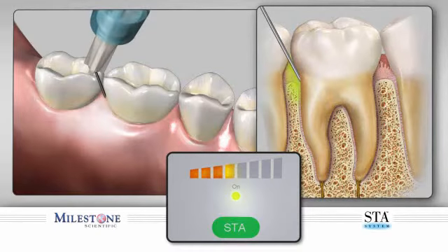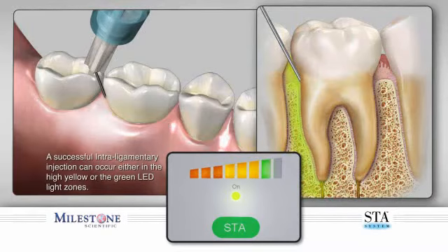Advance the needle forward slowly into the sulcus. Move the needle gently down into the sulcus until you reach resistance. Maintain approximately a 45-degree angle while holding the needle in place with moderate hand pressure. Do not use excessive hand force on the needle, as this may block the flow of solution into the tissues. Carefully control and stabilize needle movements using a finger rest. Once you feel you're at the base of the sulcus, you need to minimize movement for 10 to 15 seconds, as the dynamic pressure sensing technology starts to analyze your position.